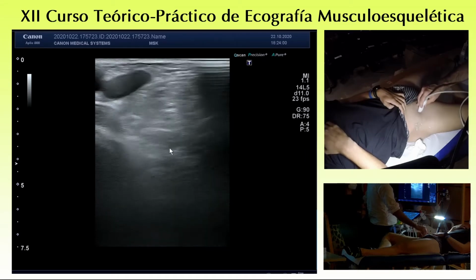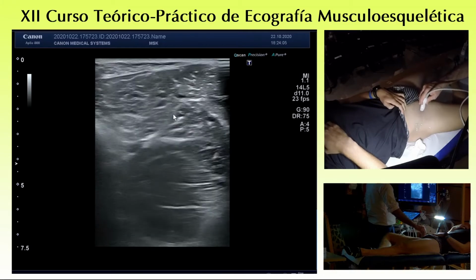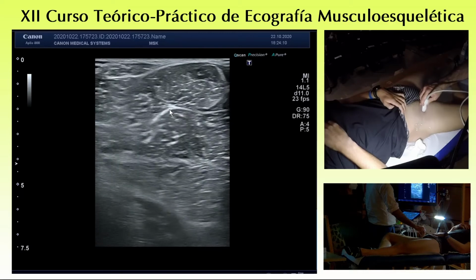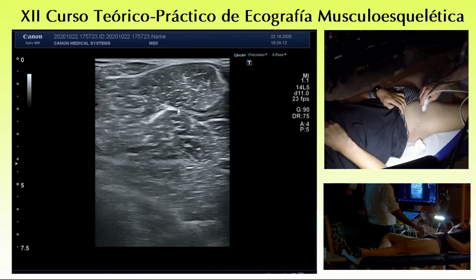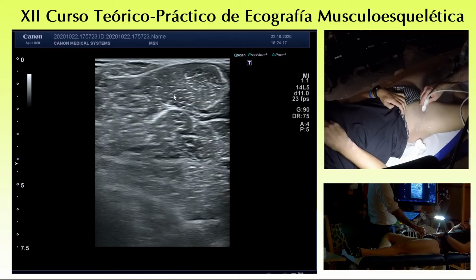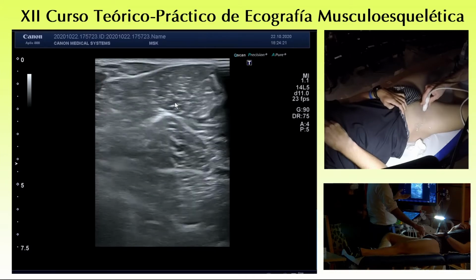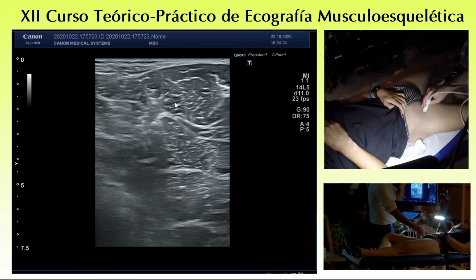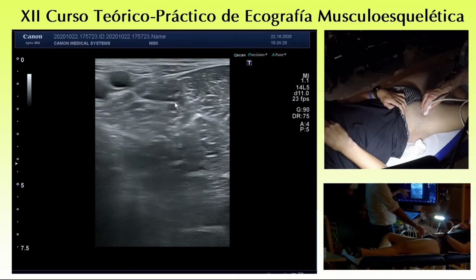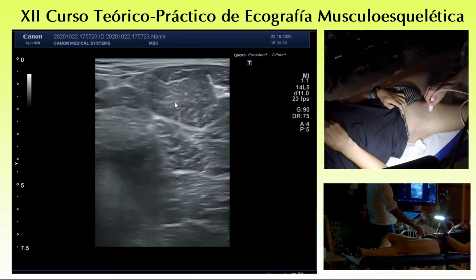Okay. There are some case reports, but no real studies in the literature, that say there is nerve injury to the anterior branch, which may occur also when you have a huge injury of the adductor. But of course, it is not very relevant to have pathology of this nerve when you have an adductor injury. Instead, the compression syndrome at this level is much more significant, as you've seen before.